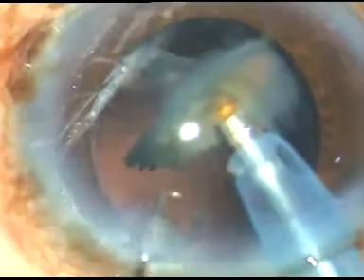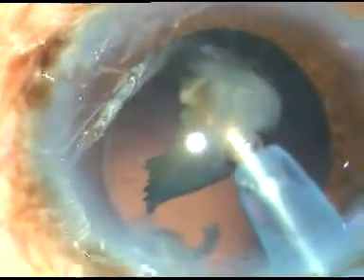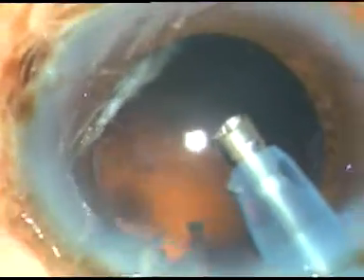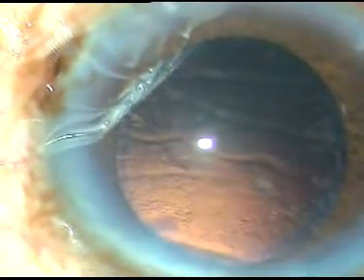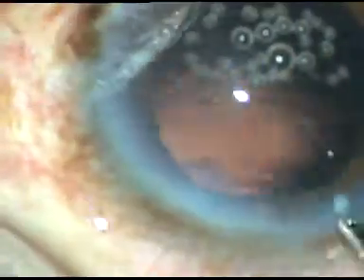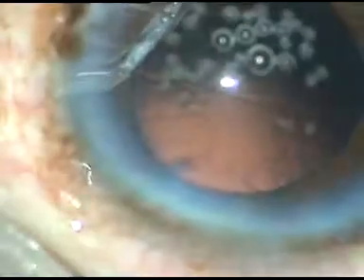The chopper is removed to make the anterior chamber more stable — the leakage from the side port stops. The posterior capsule goes towards the vitreous cavity and it is very safe to emulsify the last piece. Always emulsify all fragments while being at the iris plane. Now viscoelastic substance is injected and cortical cleanup is done.